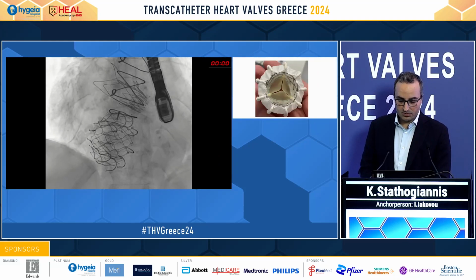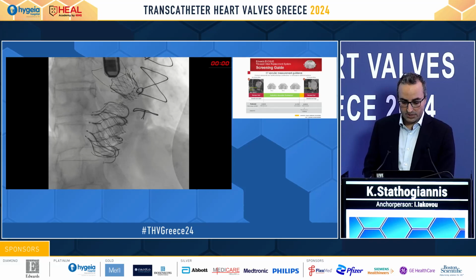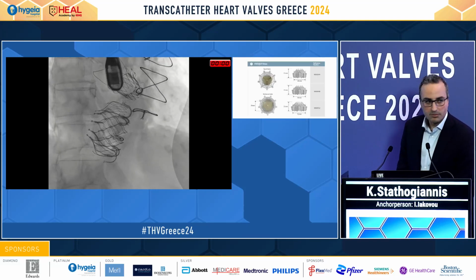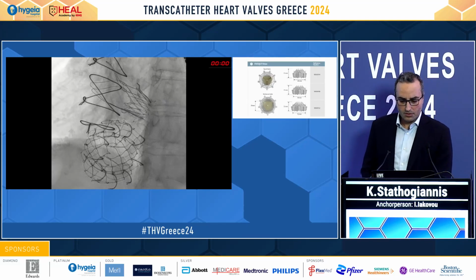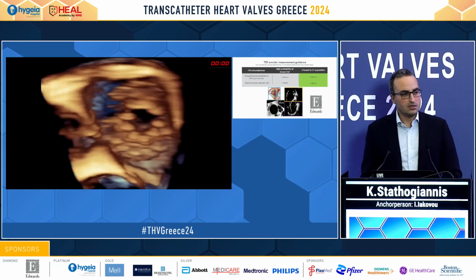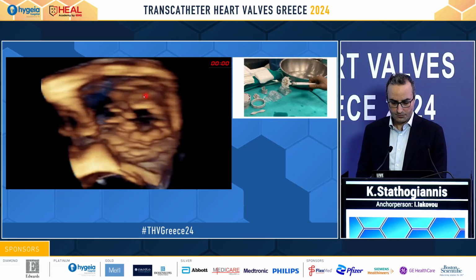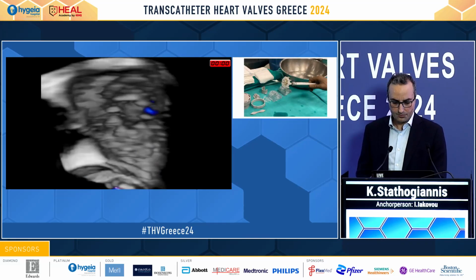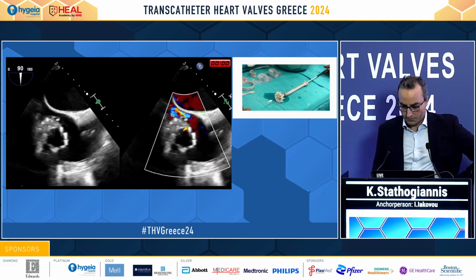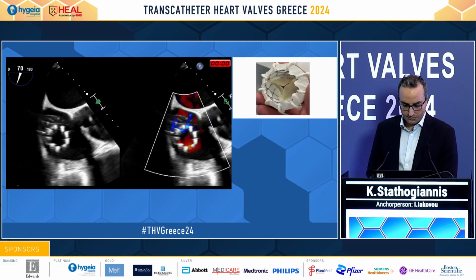And we always make sure to see whether the valve might have dislodged. And we take many angles. I don't know, Dr. Spargias, if you would like to make any comments? No, Chrissoheris, everything is fine. And another angle to make sure that everything is working fine. Yeah, and this is obviously the 3D after the procedure, looking at the valve from the right atrium. If I recall well, there was a small PVL, nothing exciting, but a small PVL was present, which actually diminished in the follow-up transthoracic images in the next few days.